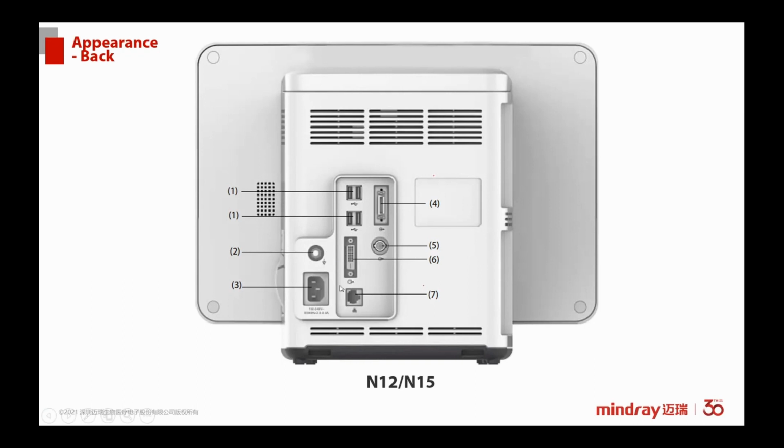Number 3 is our AC power supply. Number 4 is the SMR connector. Its function is that we can connect it to our SMR module or the N1 docking. Number 5 is what we call the BNC connector. The function here is to connect it to the nurse call.